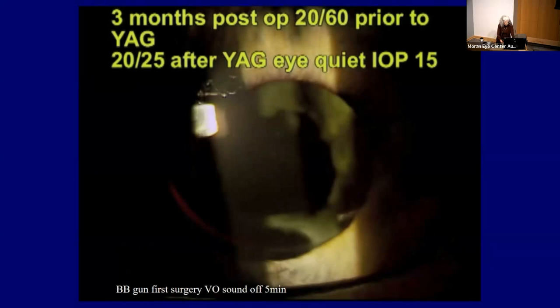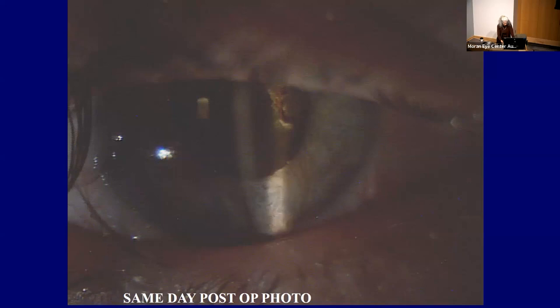At 3 months post-op, he was 20/60. We waited 3 months to do the YAG laser because there was this interesting hole here in the anterior capsule. This is the rest of the anterior capsule. So we waited and we did the YAG, and then he was 20/25 uncorrected, actually, amazingly enough, with a quiet eye and off drops.